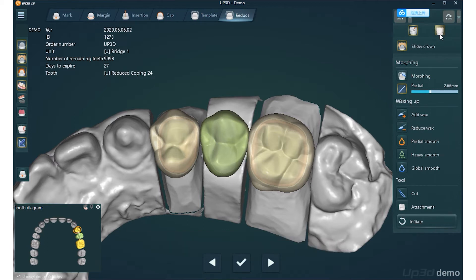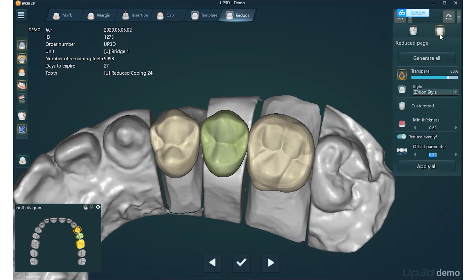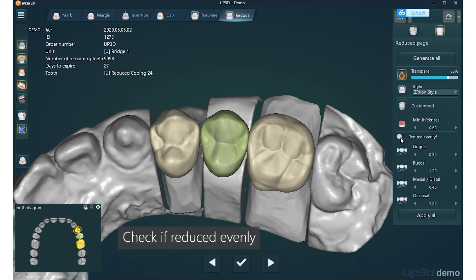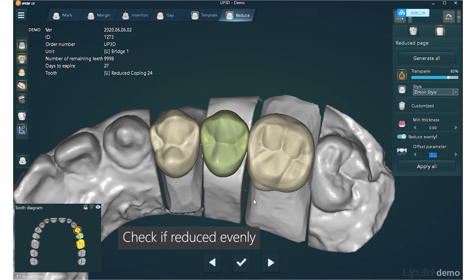If you need to modify the parameters, switch back to the step of reduced copying. Minimum thickness is the minimum thickness after reduced copying. The offset parameter is the offsetting parameter. If different areas need different parameters, please turn it off — it will show the reduced parameter for each individual area to choose from this interface.